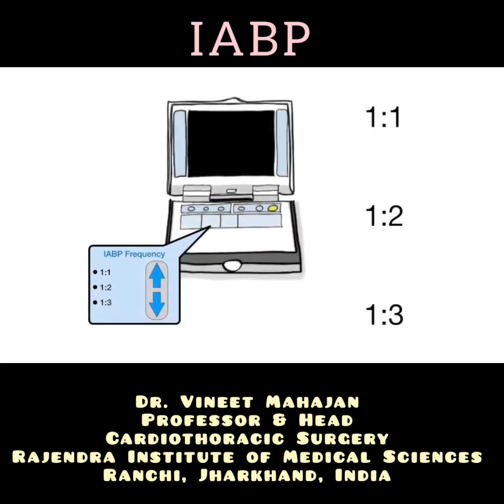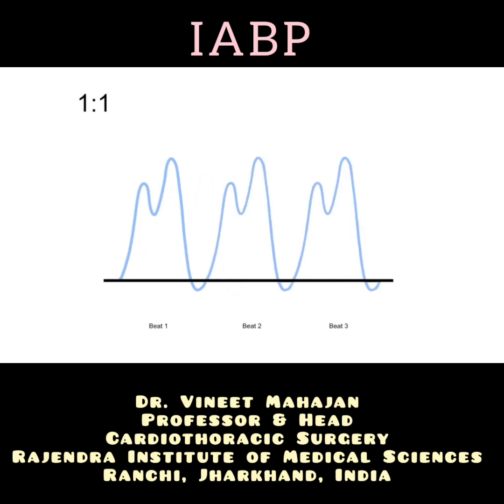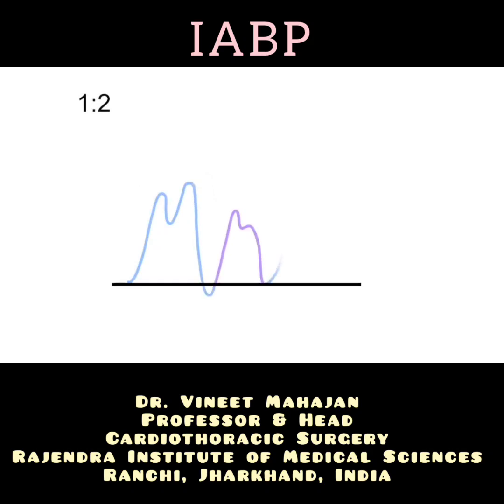There are 3 cycles that can be set on the console for the intra-aortic balloon pump: 1-to-1, 1-to-2, and 1-to-3. 1-to-1 represents inflation and deflation of the balloon pump with every heartbeat. Notice how every beat has an augmented diastolic pressure indicating coronary perfusion and a drop in end diastolic pressure indicating afterload reduction. 1-to-2 represents the balloon pump inflation with every other heartbeat.